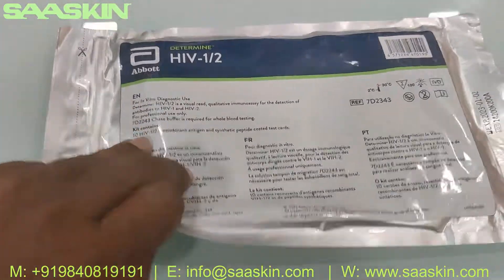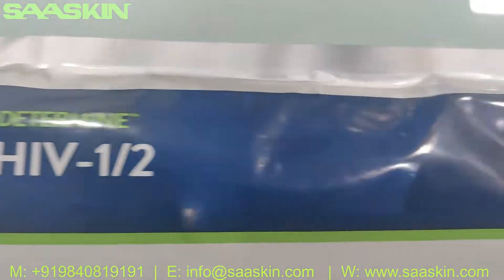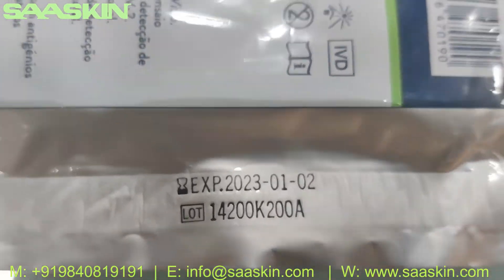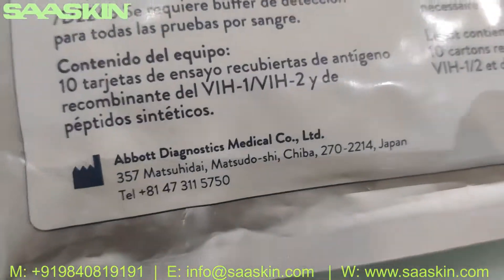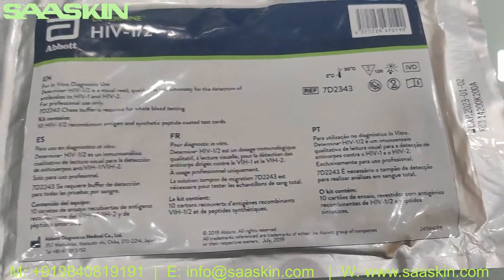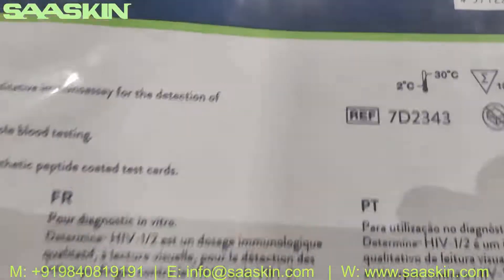This is how the test kit pack looks like. You can see that the expiry period is given here along with the lot number on the edge. This is manufactured by Abbott Diagnostics Medical from Japan division.